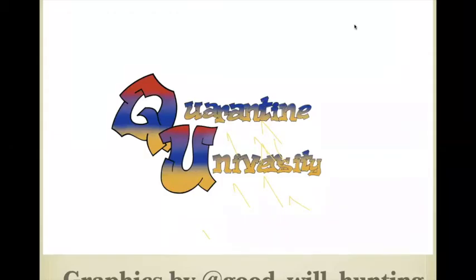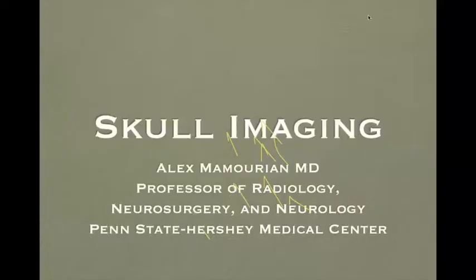As you may have discerned, the intent of this program is to alert you to the findings that you can see on imaging that will often lead to misdiagnosis or unnecessary testing. And today I want to talk about imaging of the skull because it's an area where we often see things on the imaging that are not clear to us.